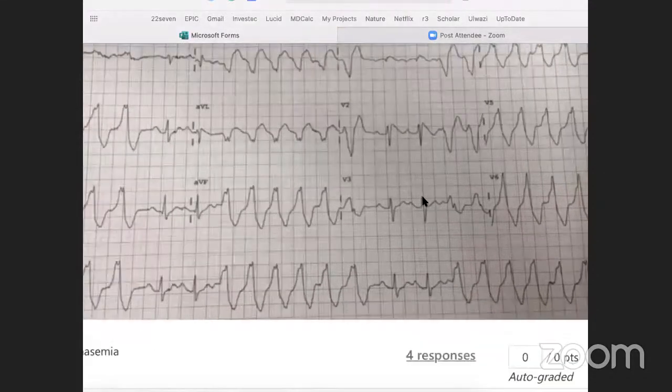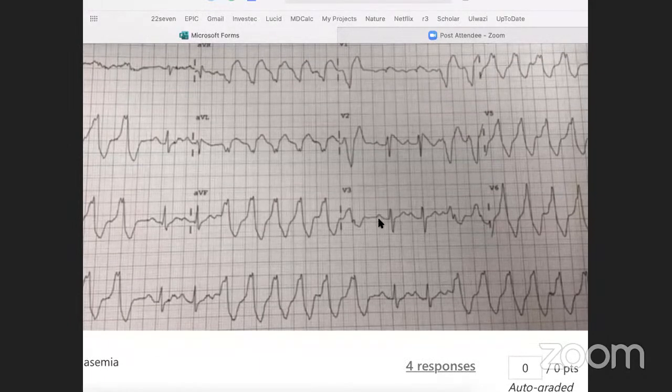And so when I look at this ECG, I look at the normal waves. I can see my rate is going 1, 2, 3, so it's going just under 100 beats per minute. The rhythm at this stage is regular. And then I look at my waves, they look normal as well. Either this is a U wave or it's a first degree heart block. But of concern is that I have a prolonged QT. So my Q to my T is prolonged. That would be suggestive of hypomagnesemia that's causing my ventricular tachycardia, and that could lead to torsades.